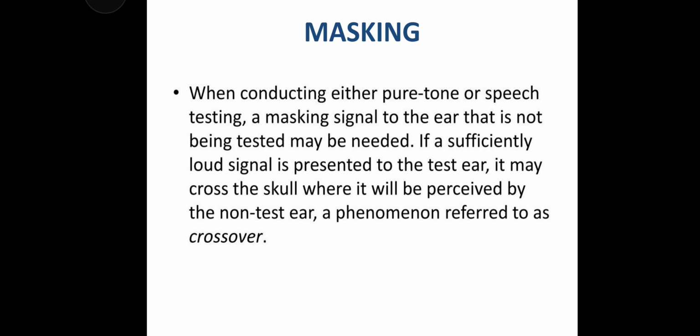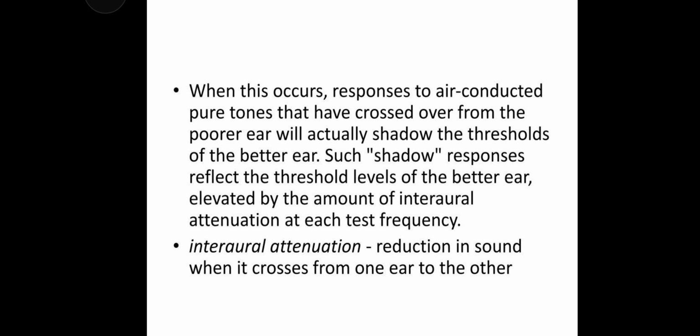Masking. When conducting either pure tone or speech testing, a masking signal to the ear that is not being tested may be needed. If a sufficiently loud signal is presented to the test ear, it may cross the skull, where it will be perceived by the non-test ear, a phenomenon referred to as crossover.